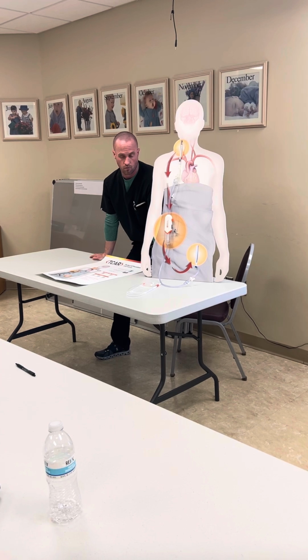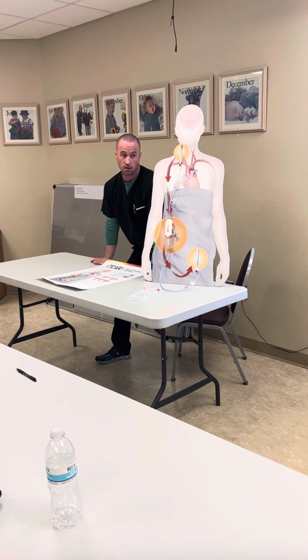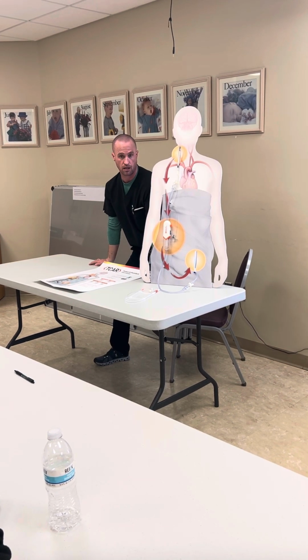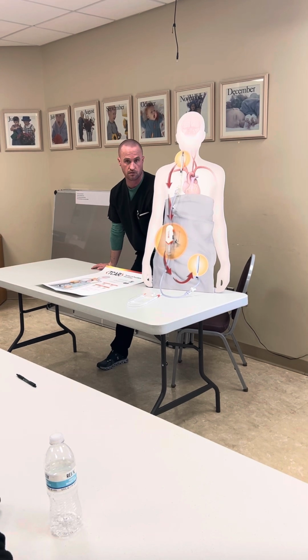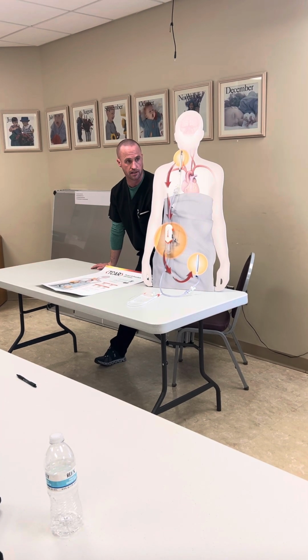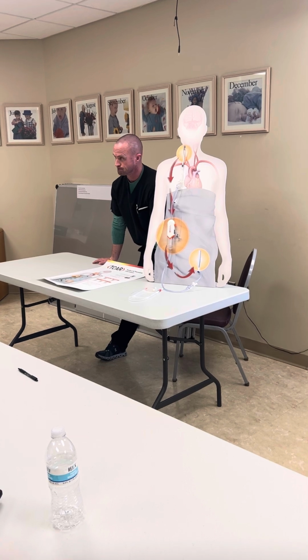Usually we'll bring a couple other extra wires in just in case. 99% of these cases are 014 wires doing the job, but occasionally you might have some tortuosity or something weird. We just got acquired by Ball Scientifics, and my hope is that maybe I can start carrying some of their wires and balloons as add-ons in case I needed them. That'd be helpful. Chris, what tray do you think?